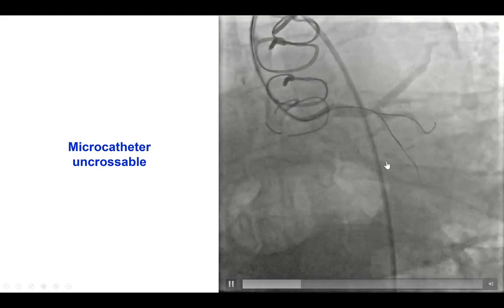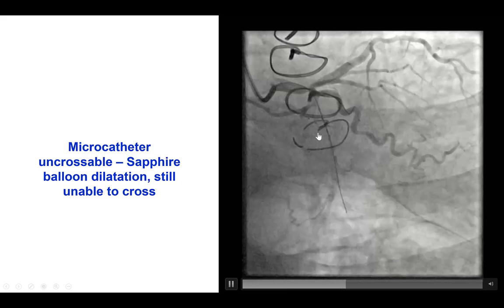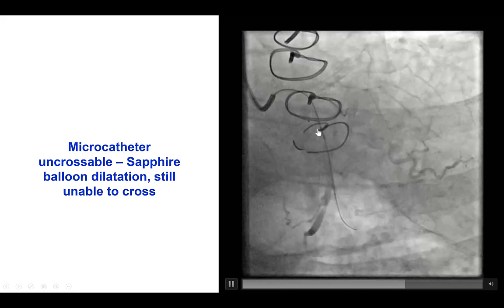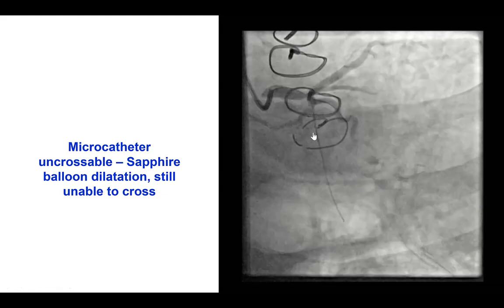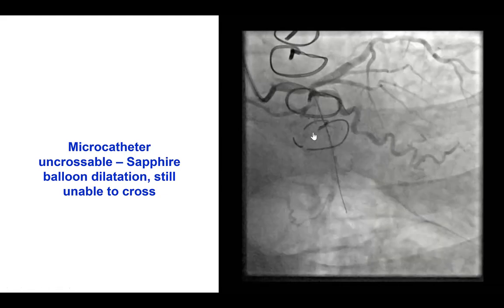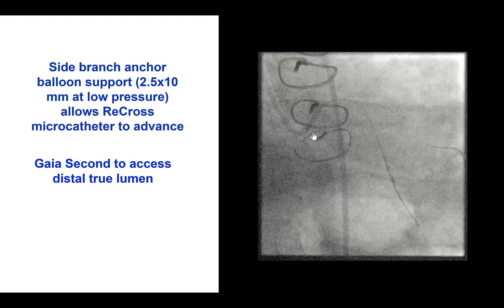The Corsair XS could not cross. We used a Sapphire Pro, which is the most common first step for balloon-uncrossable or microcatheter-uncrossable lesions. But despite that, we were still unable to cross with a microcatheter.